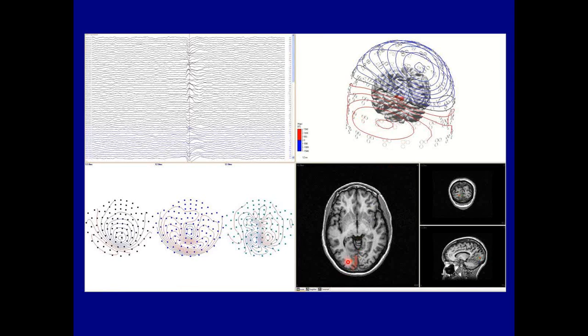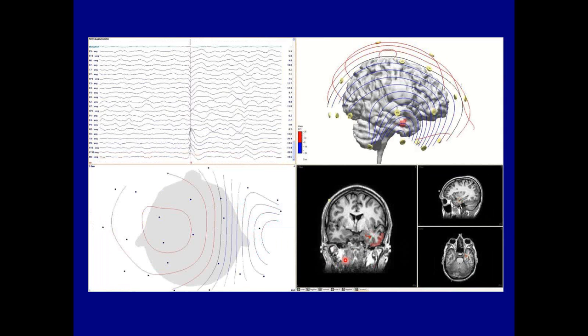Here is the MEG dipole, and this is the cortex that's associated with this dipole. This is the putative source of this potential here in the mesial occipital region, an orientation of cortex that would produce a very nice tangential field seen by MEG.